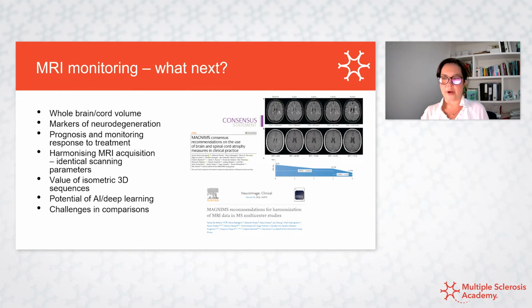a reduction in brain volume loss as a response to treatment. So if you treat the disease effectively, you slow down the volume loss in patients.